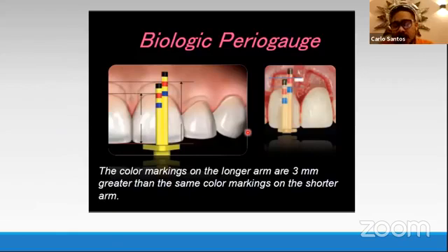Again, I was stressing a while ago that the biologic width is very important. So what you do is, where the horizontal line lies, the corresponding red horizontal line should touch. This is where you cut, where you incise. So maybe you'll be asking, can I use a laser? You can use anything as long as the principle is correct.